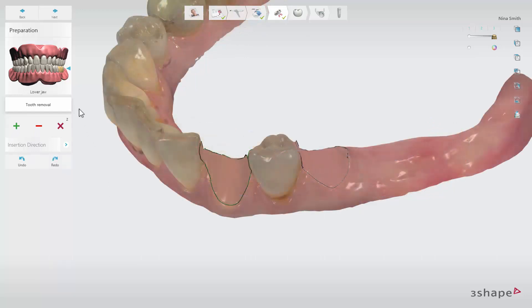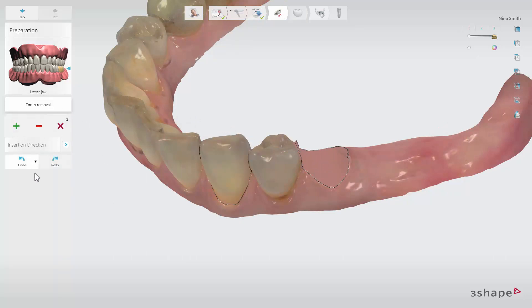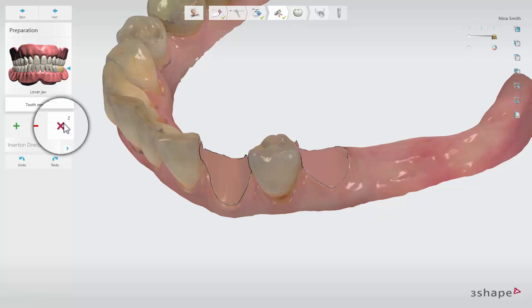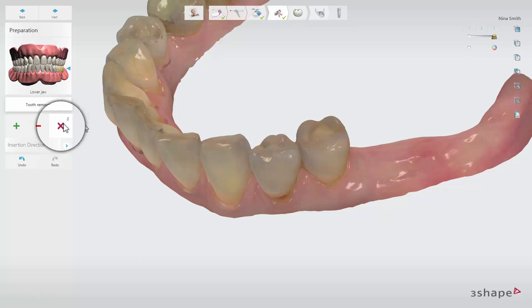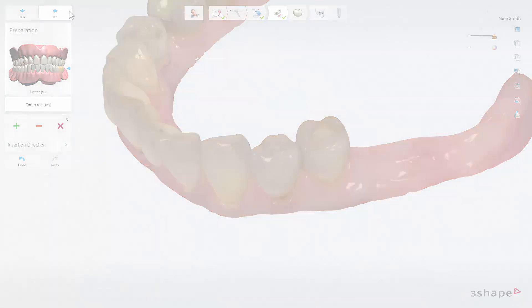To remove a patch, click on the minus icon which will remove the active patch. You can remove all patches by clicking on the red cross symbol, which will clear all patches. Click Next to proceed to the Anatomy Design step.